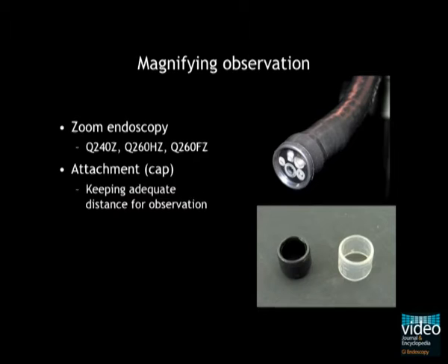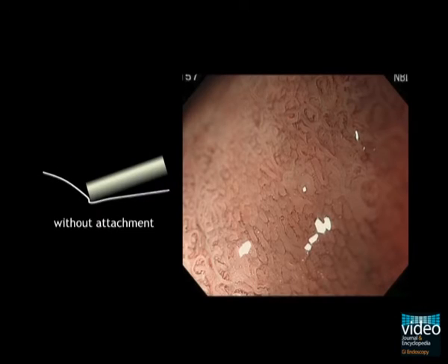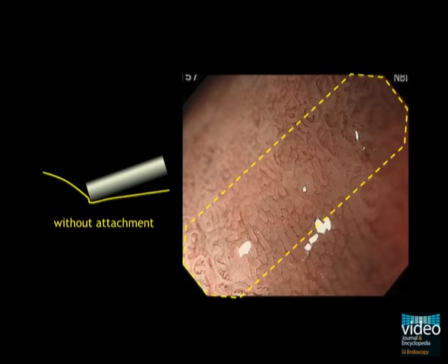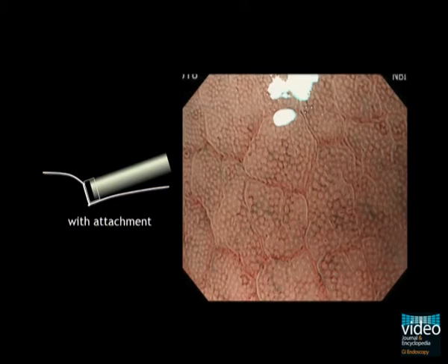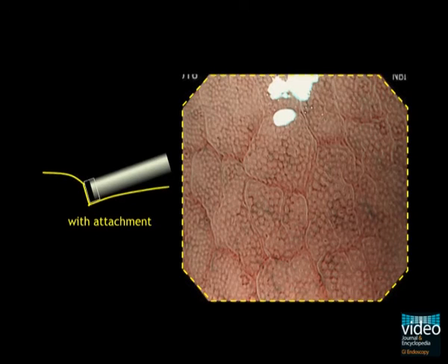When using a magnifying endoscopy, we always equip an attachment cap on the tip of the endoscope. Under magnifying observation, the depth of image field can be narrow, so when the mucosa is observed without the cap, it becomes oblique and only narrow areas are in focus. However, when a cap is used, the mucosa can be straightened towards the lens and the whole endoscopic image field can be focused upon.